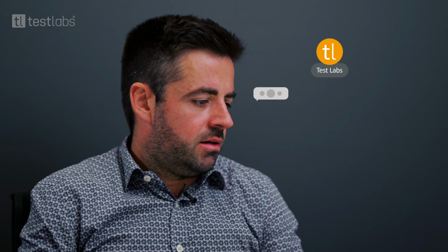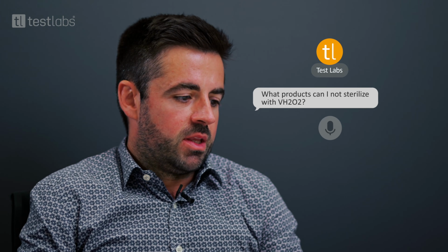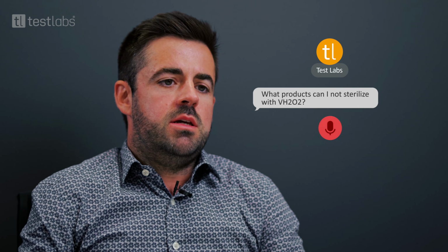What products can't I sterilize with VH2O2? VH2O2, as any other sterilization modality, has limitations. There are clear physical limitations with materials that cannot sustain deep vacuum, with liquids, and with powders. These are really physical limitations that we cannot overcome.